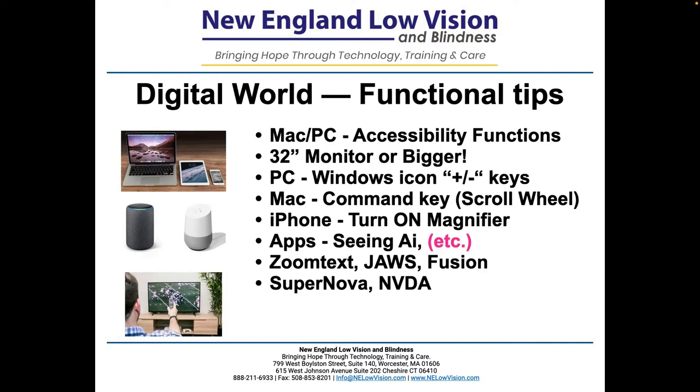If Cortana or the screen readers of your device are not sufficient, then JAWS is kind of the next step, all right? These are expensive. JAWS is about $1,000, ZoomText about $700. There are some deals that they work through the American Printing House, so check that out. But they're expensive software. This whole field is expensive. That's just what it is, unfortunately.